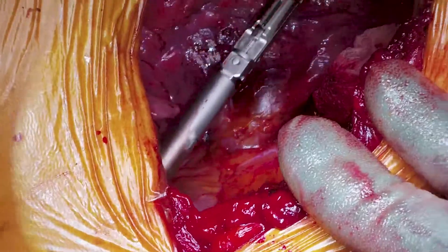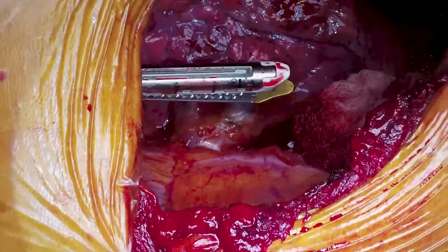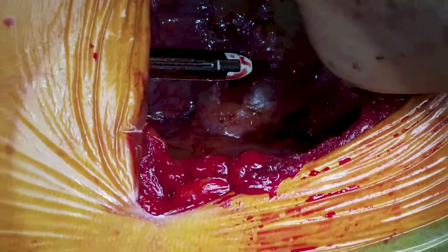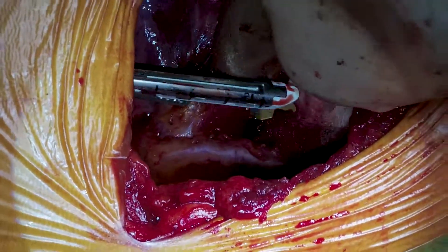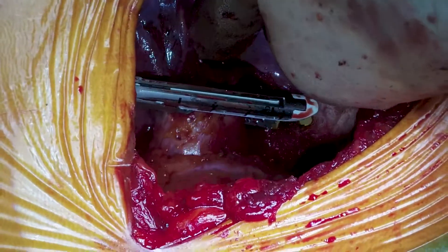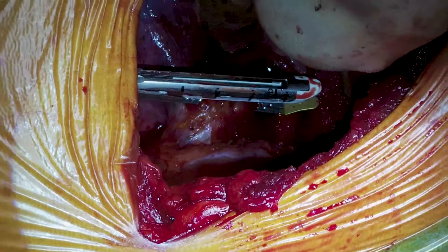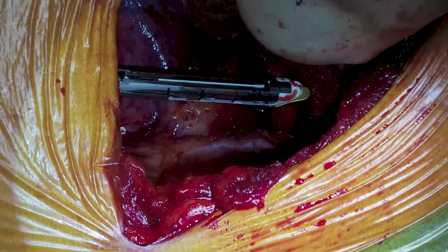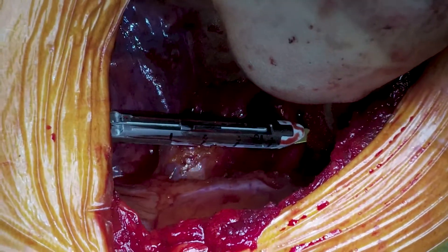We made a port in the anterior part of the chest that we were going to use for the chest drain anyway, and we access the chest with the stapler through that hole. This is the brand new white load 8mm Medtronic stapler, which is considerably smaller than the 12mm. We can use that port easily without any extra large holes, and we're stapling off the right upper lobe vein while preserving the middle lobe vein.